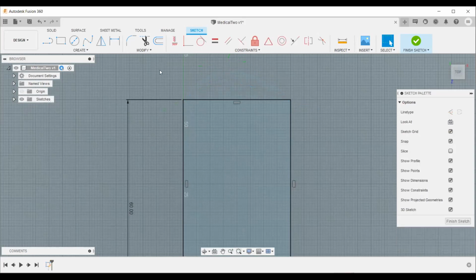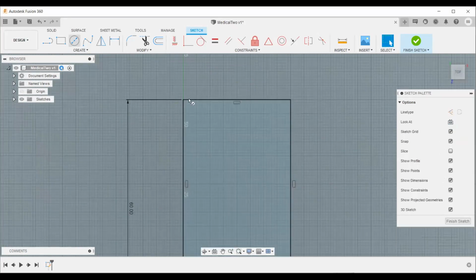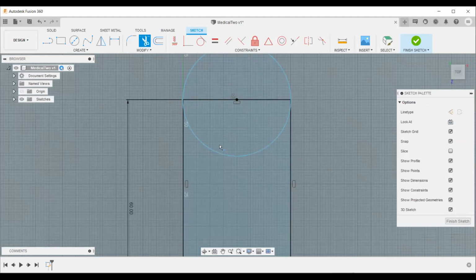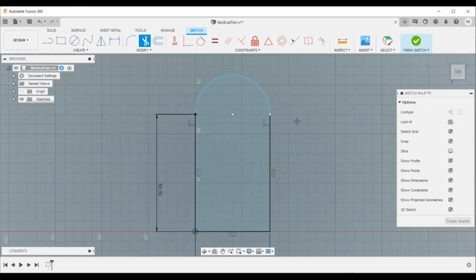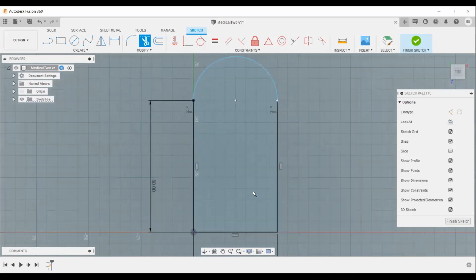So if you are to take a circle, then you draw it from the center. So how do you identify the center? Something like that. And then remember we looked at trim. So you can trim this, you can trim that so that you are having a circular part like that. Everyone, can you see? Yeah. Everyone, can you? Yes.